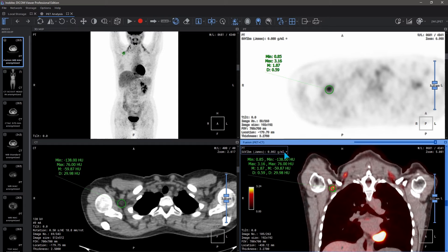The current SUV value of the area under the cursor is always displayed in the upper left corner of the active window.